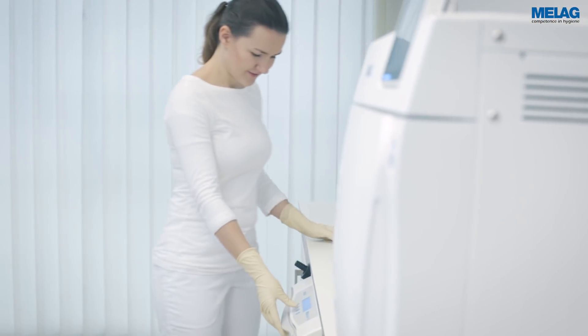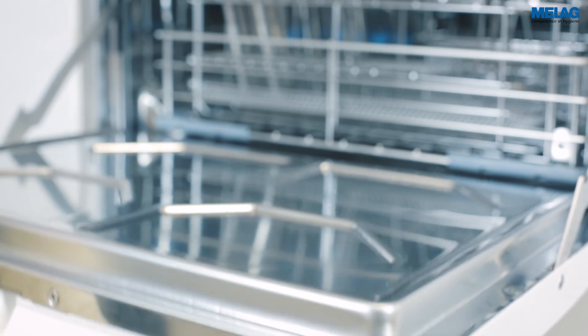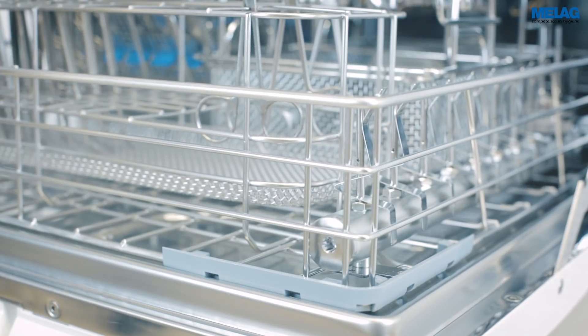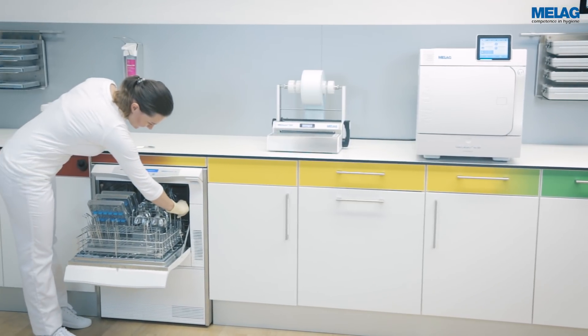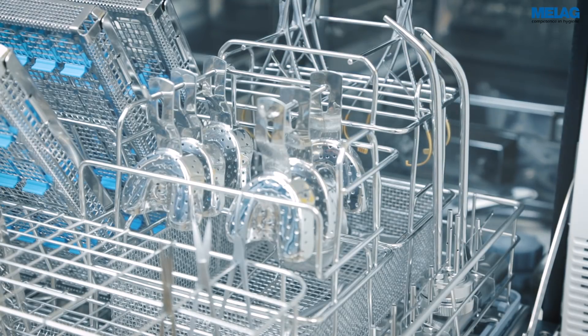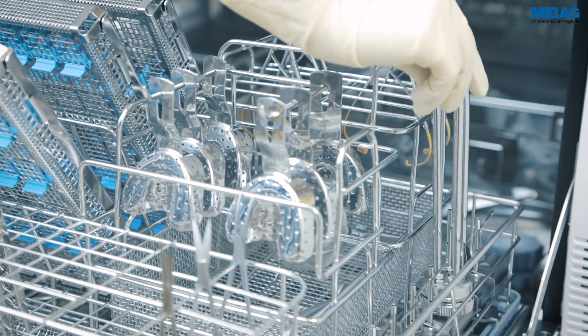The decontamination of hollow body instruments is assuming an ever greater importance in dental clinics. The narrow inside diameter of surgical suction cannulas requires the placement of an injector nozzle. Where necessary, the number of injector nozzles can be increased through the use of a triple distributor.